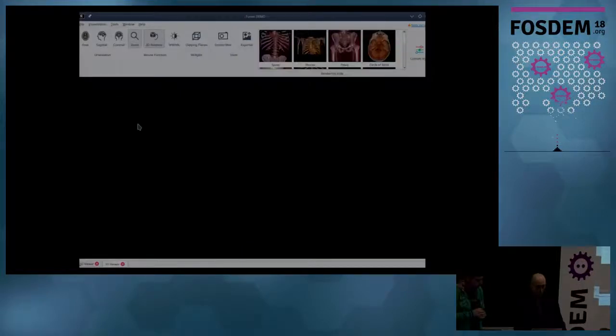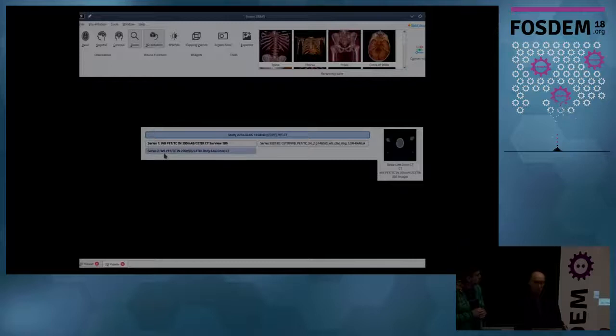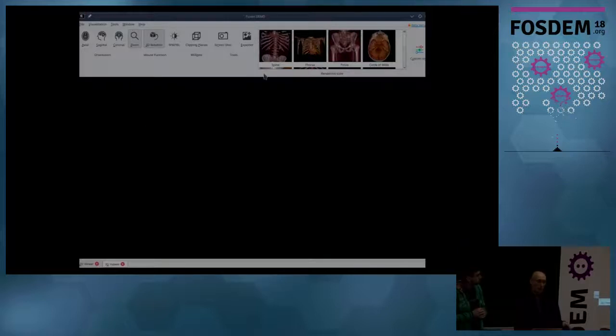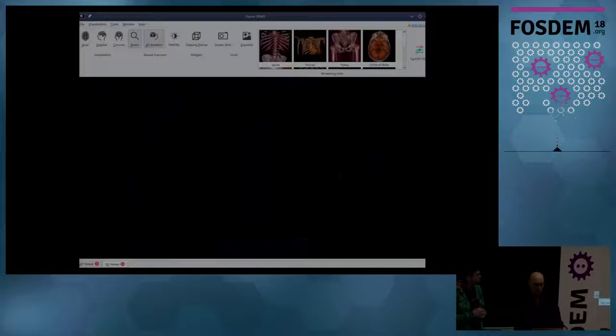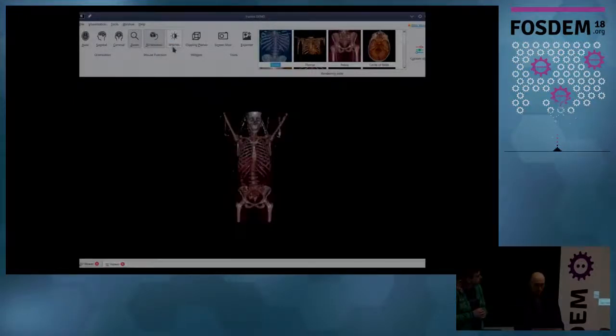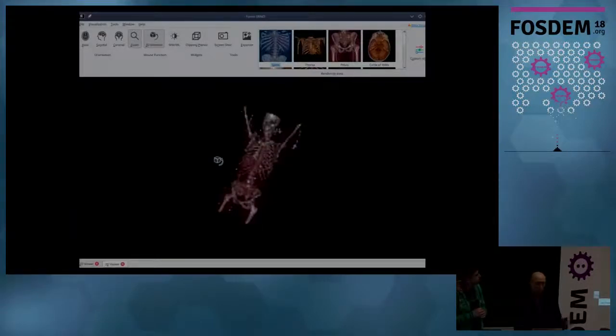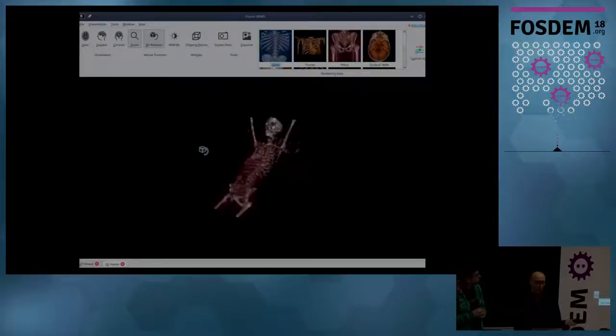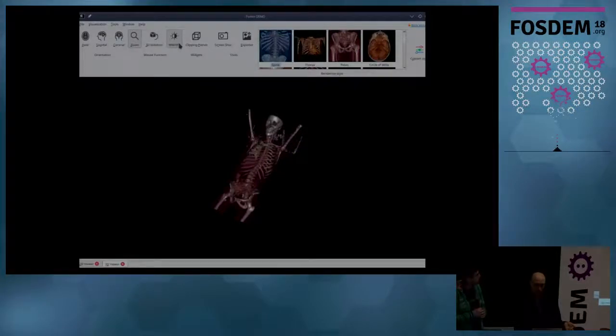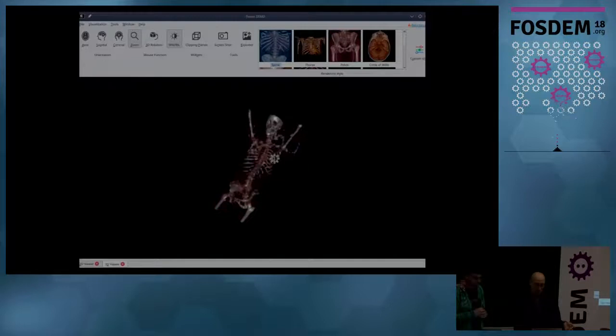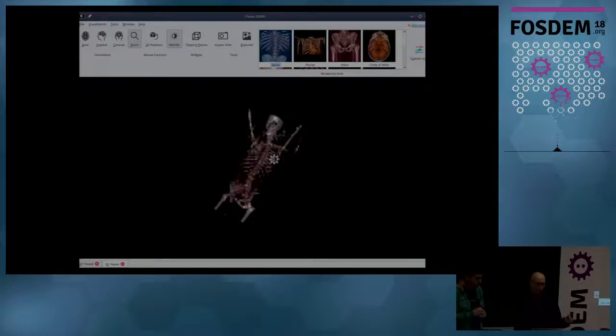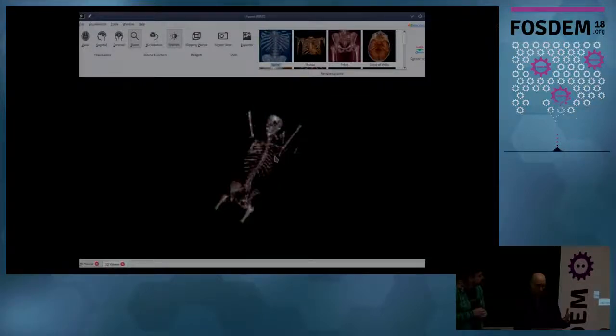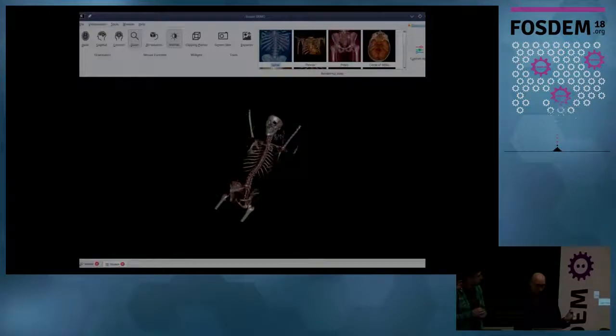Now I will move to the 3D visualization module, which does 3D volume rendering, which is done usually through CPU, but it can also be accelerated using a GPU. I will choose this series, and I will apply this transfer function. It's the way you paint it, and I can rotate it, and here we have this poor man laying down. With volume rendering, this is all filled, so I can change the opacity to see occluded parts.